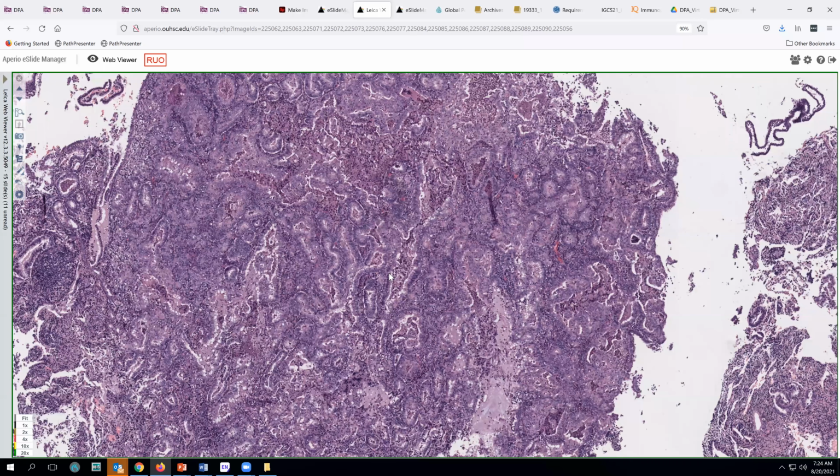In our referral practice, we see not infrequently, a few times each year, cases that come in as supposedly low-grade endometrial adenocarcinoma that in fact turn out to be serous carcinoma that just has been overlooked or underappreciated by the initially evaluating pathologist. So consider doing a p53 stain, especially if you're seeing any suggestion of higher grade nuclei.